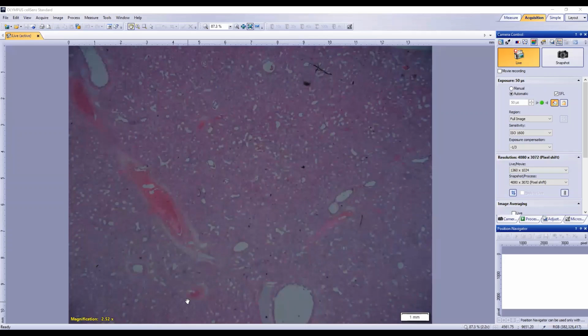We don't tend to see acute lung in cattle just because of the nature of the production system, and they tend to be quite stoic. So they'll keep going on until things are a little bit more chronic, and then that's when we get to see the histology. And of course BRSV, IBR, they'll do multinucleated giant cells as well, or multinucleated cells and syncytia.